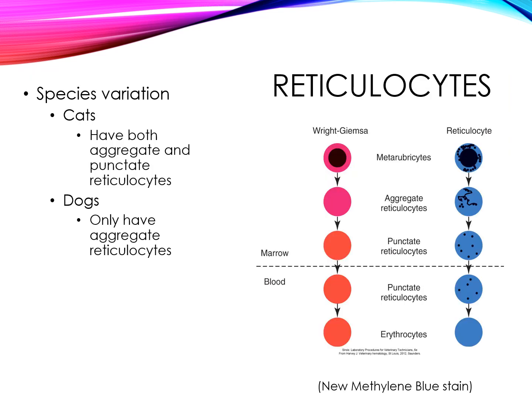Okay, we're going to talk a little bit more about reticulocytes. On the right here, you have this diagram which shows what some red blood cells and reticulocytes would look like in different stains. On the left here, we have the Wright-Giemsa stain, and on the right, we have the new methylene blue stain, which is used specifically to see reticulocytes because, as you can see, it stains the RNA within the cells better than the Diff-Quik type stain. Here you can see a nucleated red blood cell up top, and then these are reticulocytes where in the Diff-Quik stain you can't see the chromatin that is in them.